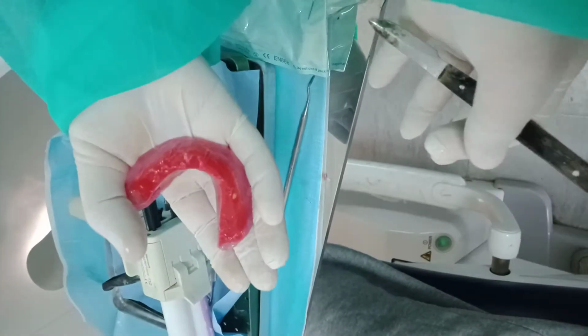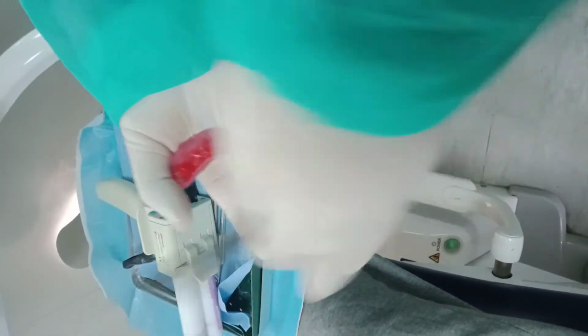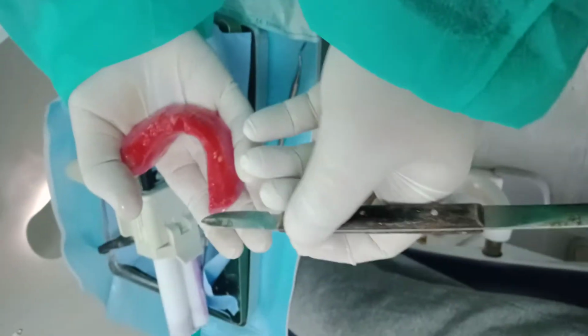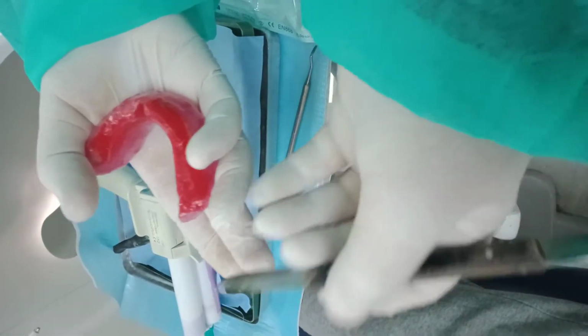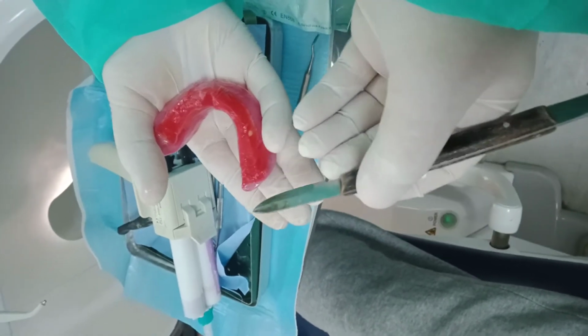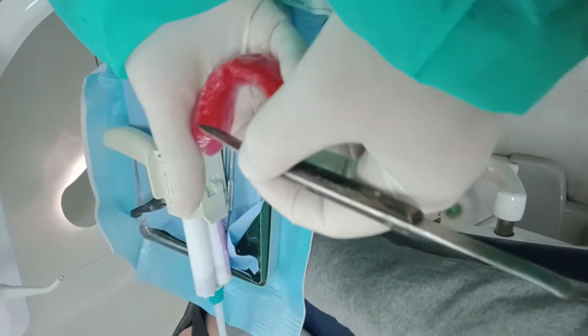If the wax comes out, if the rubber comes out, the occlusal, I could put it back and orient it back. Like a V shape? Like a V shape, a small V shape. So heat this instrument. Okay. While it's very hot, put it inside. Just do like this and this. It will become like a V shape. So one here, and another 2 here.